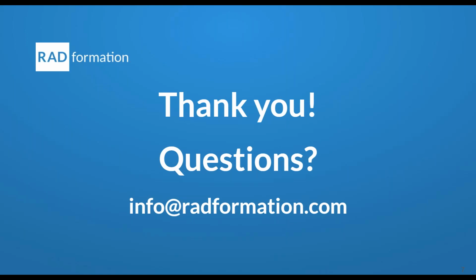All right, sounds good. And this one I think will be an easy question: does ClearCheck or ClearCalc check for collision issues, especially with SRS cone plans that use arcs with couch kicks? Yeah, so ClearCheck is the one there. It has a collision check module that's actually really awesome. And you can even build in a warning ring around it, just because I know sometimes, especially as you get into couch kicks, you don't scan the patient all the way down to their waist, or even past their shoulders for those SRS plans.